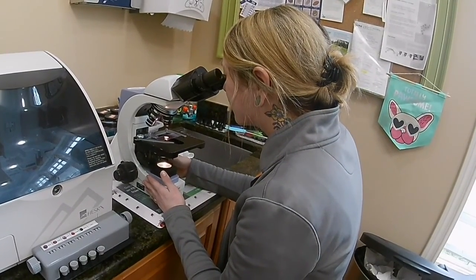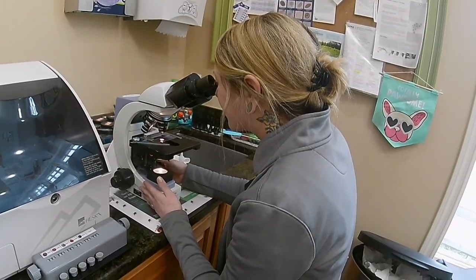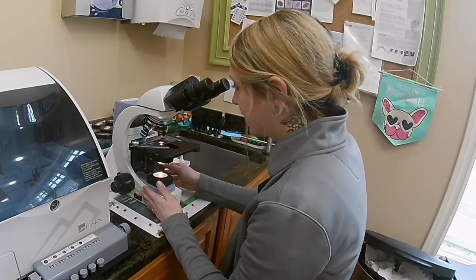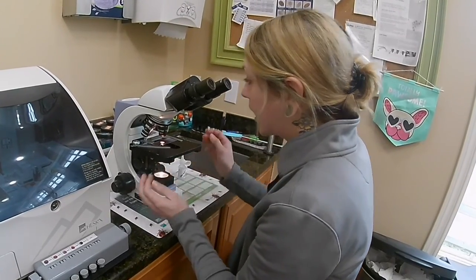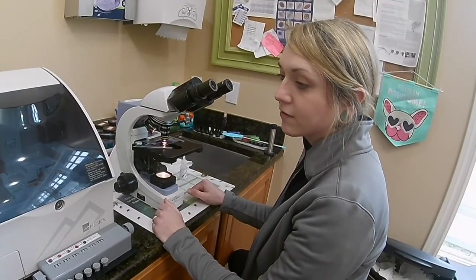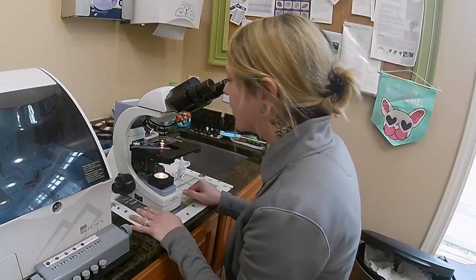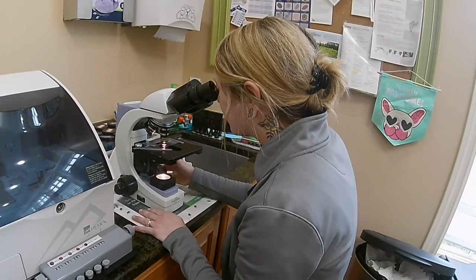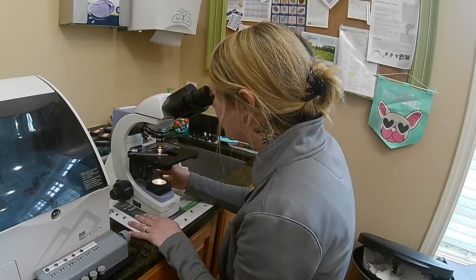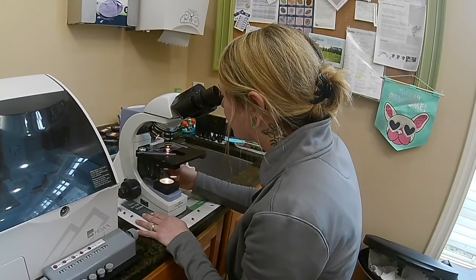So I'm going to use the coarse adjustment knob to get things more in focus here. Alright. So I got that here. I'm going to switch over to low power. Under low power, I'm going to be looking for any clumping of cells, any hemoparasites, anything that looks abnormal that I might want to document. But I'm also using this to help get myself in focus before switching over to oil. I'm just using the fine adjustment knob on my low power objective lens.